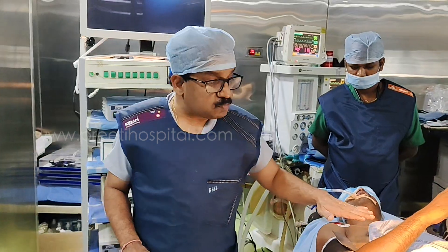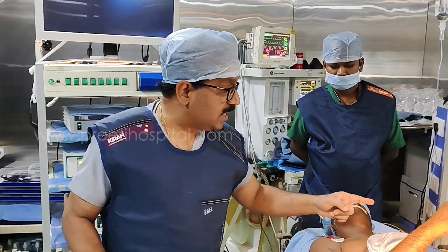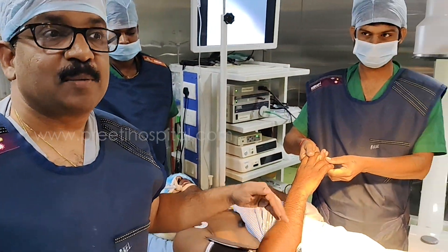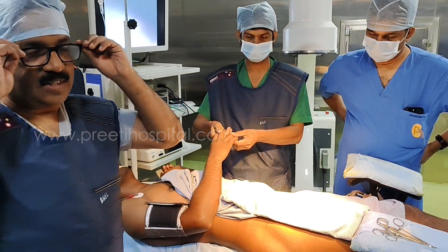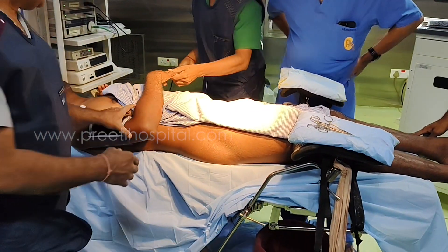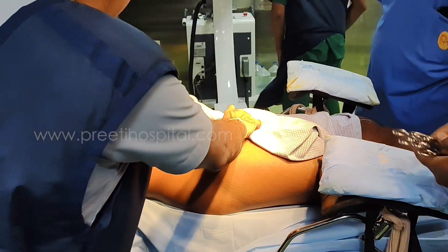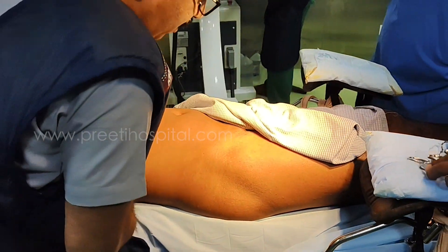Supine PCNL — the patient is in flat supine position. He is ready to shift, turning to the edge. That is the control. For supine PCNL, get the C-arm and turn the patient normally, keeping this arm in position.